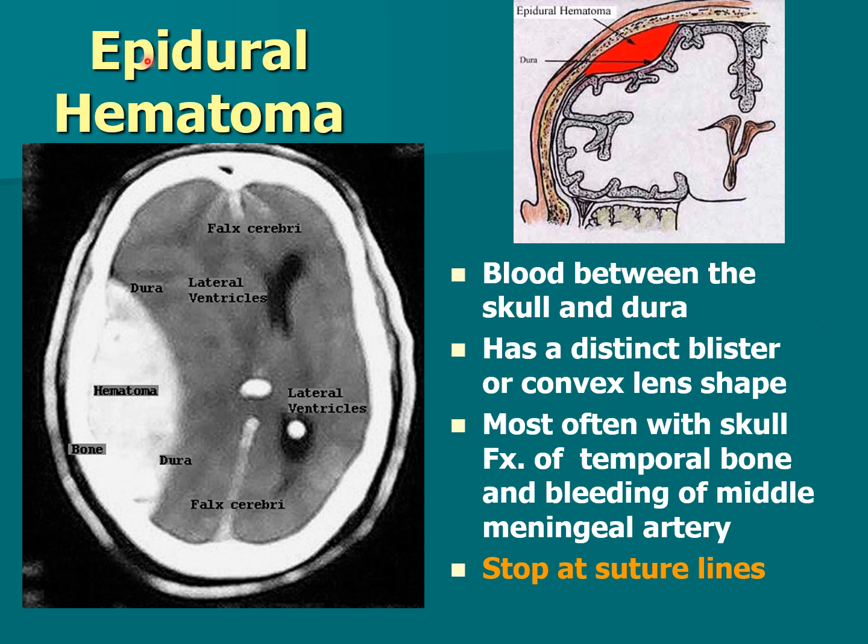So if we look at what an epidural hematoma looks like, we can't see the dura here, but there's just a potential space between the dura and the skull. If we get bleeding here, that would be the dura coming here, it's a tough fibrous covering like leather. So it is not bleeding into the brain tissue, it's between the covering of the brain and the skull. So that's the hematoma. The bones here, the hematoma, and the dura going here.